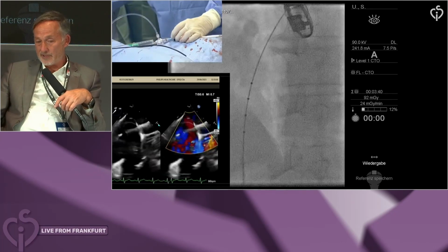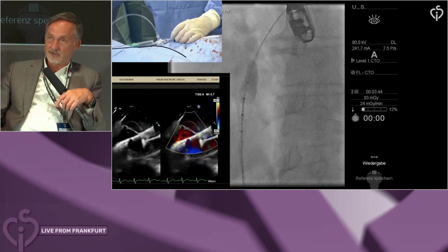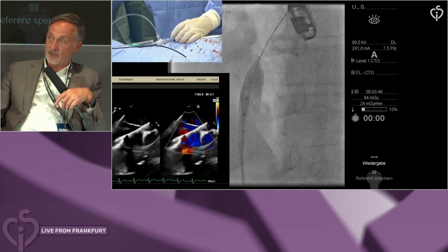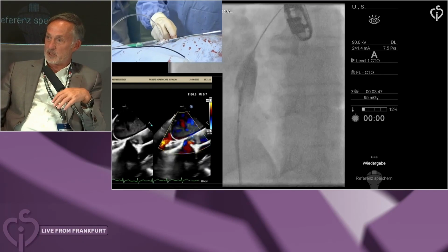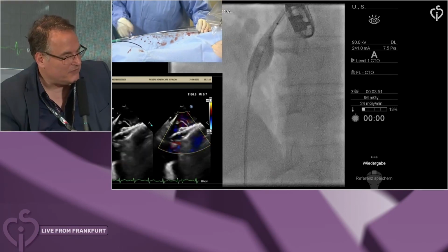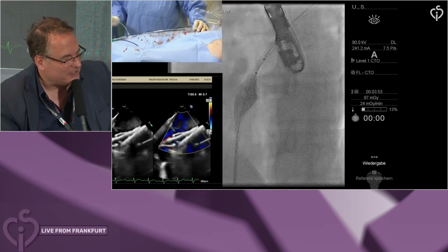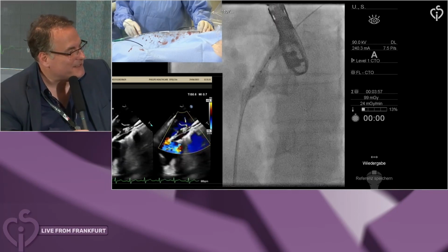Well, Horst is very careful about measuring pressure, which is important because there was a study from England where they aggressively detunneled by overexpanding a balloon and breaking it. It's like making a Rashkind maneuver and then closing the bigger defect. You know, it of course gives you more impressive data on sizes, but yeah.